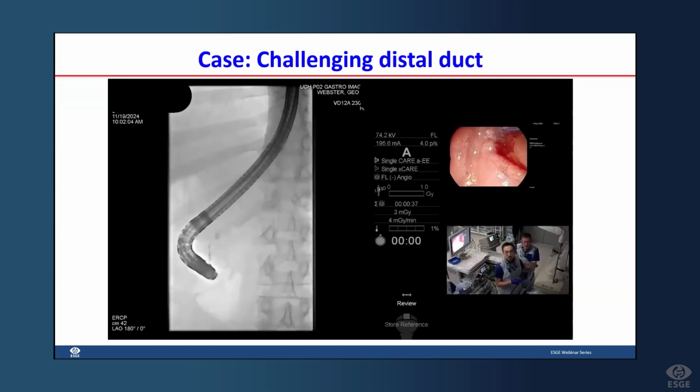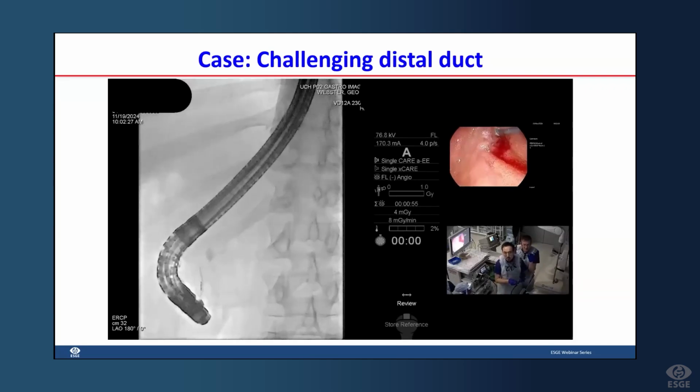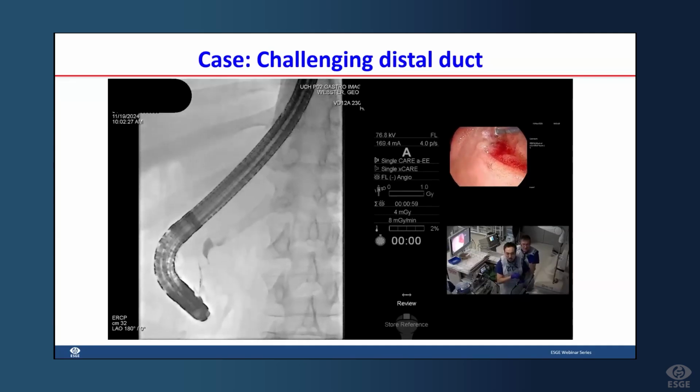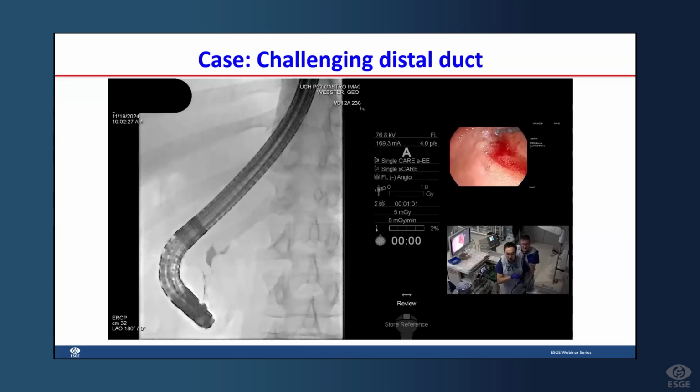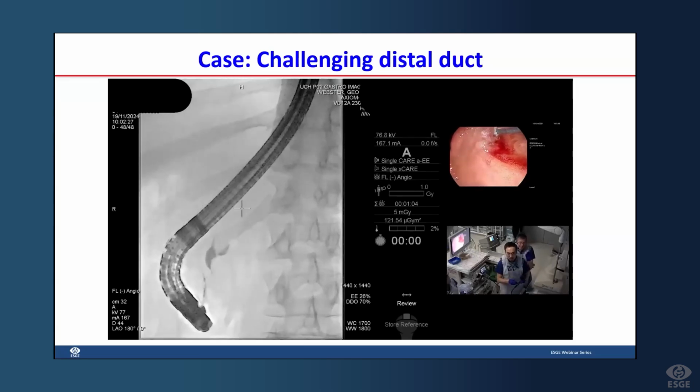So there we are, you're filling the, well, what are you filling there? Yeah, just inject a little bit more there, because you might be filling the lower end of the bile duct with a sigmoid bile duct. And there you are, it's exactly what you're doing, and there's the stone. Stop there. Now, take that picture. So that's really interesting. How are you going to get into the bile duct here?